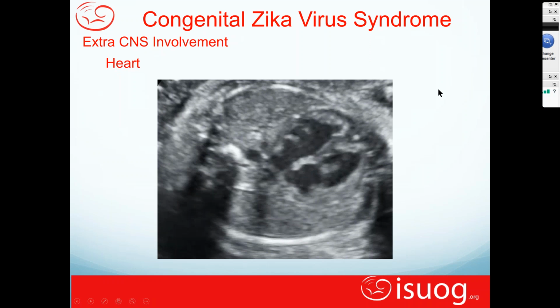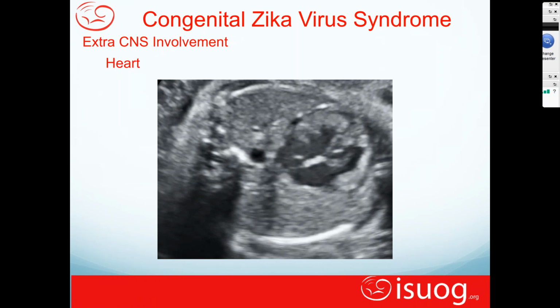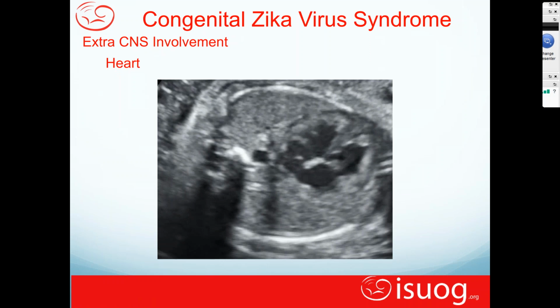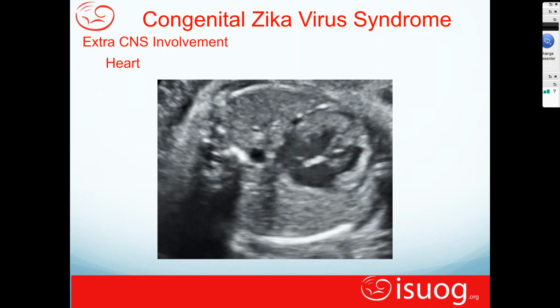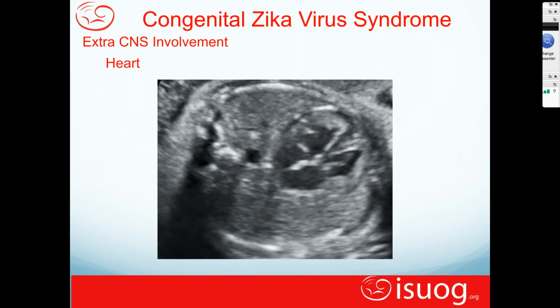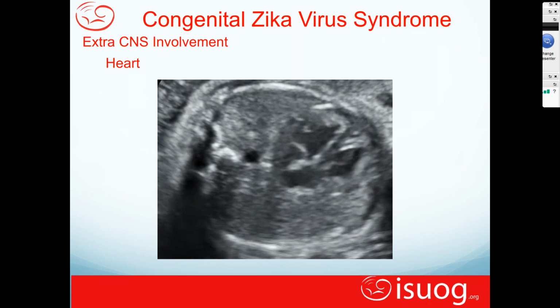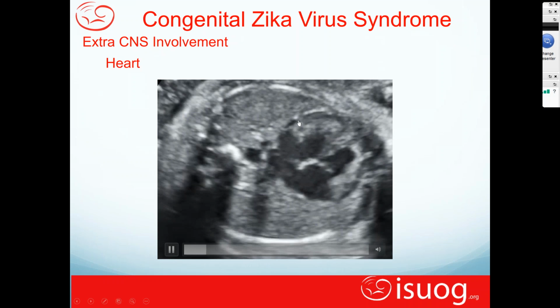Essentially, cardiovascular changes as well, and there's a big question of whether EIFs should be suspected in cases that are there. We recently submitted a paper where I did identify some cases that have EIFs that may be part of the Zika syndrome, but as you and I know, we see so much of the EIF, and isolated EIF is not a reason to suspect Zika unless there's been direct exposure. But there certainly can be changes along the wall that go along with it. Here you can see pericardial effusion and some dysfunction in this case.